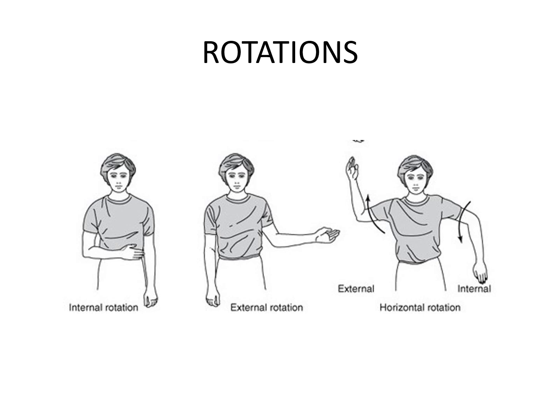So I will repeat again everything so that you don't get confused. The first figure is shoulder internal rotation at 0 degree position of shoulder, which is the neutral position. So when you take the arm towards the tummy, that is internal rotation. When you take it away from the tummy outwards, that is external rotation.